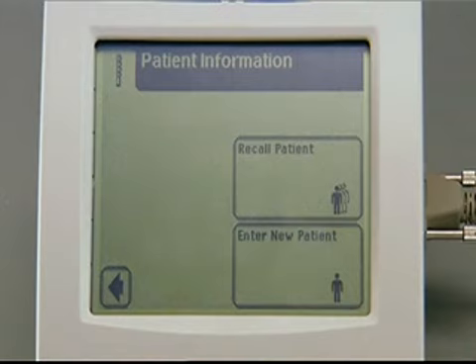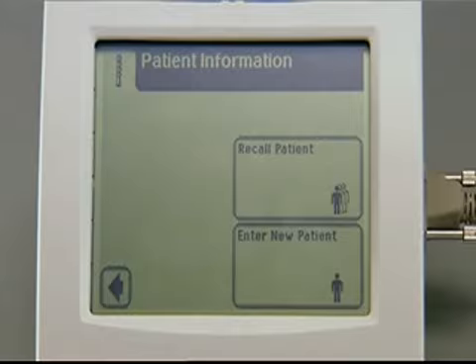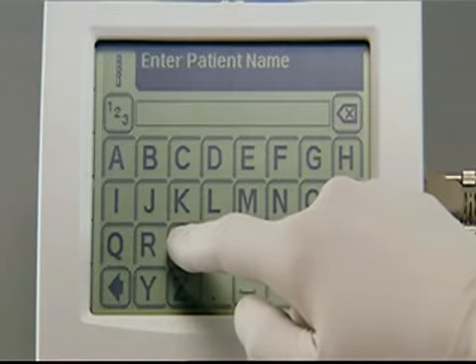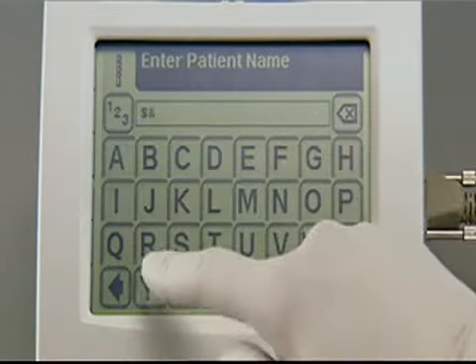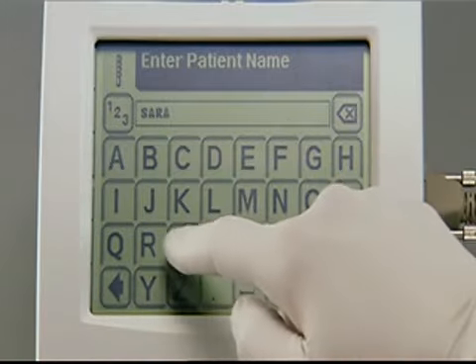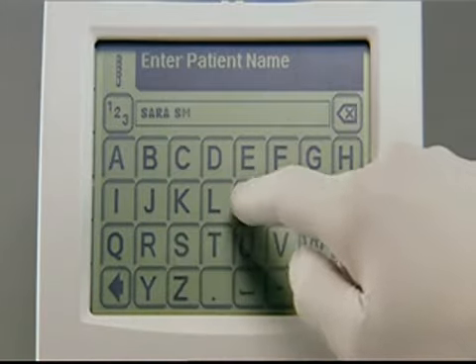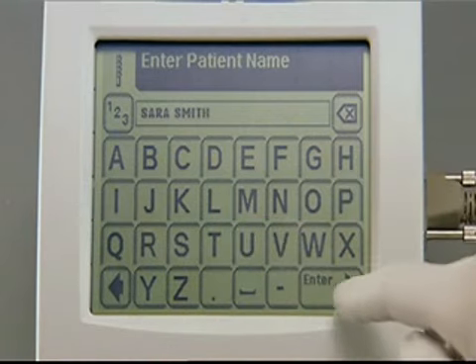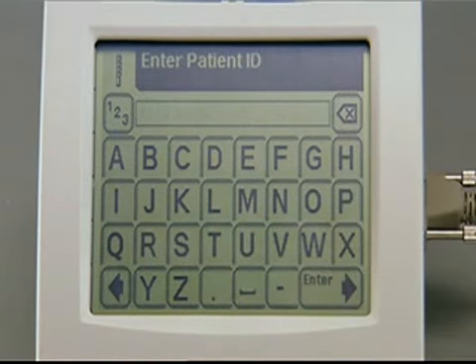The Patient Information screen contains two options: Recall Patient and Enter New Patient. For a new patient, touch the Enter New Patient button. On the Enter Patient Name screen, use the keyboard to enter up to 20 characters. Touch Enter to accept the entry and proceed to the Patient ID screen.